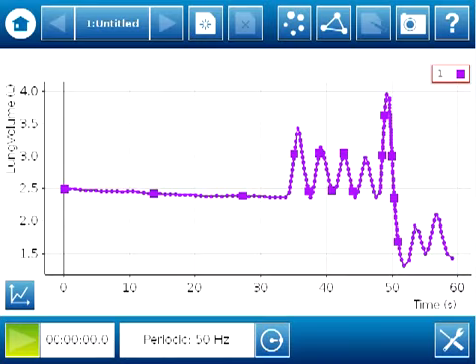In this video, we'll focus on using the built-in tools of SparkView software to analyze data related to changes in lung volume. In part 1, I collected data under two conditions: normal breathing and maximum inhalation followed by forced exhalation. We'll use that data to find tidal volume, vital capacity, and forced expiratory volume in 1 second. Let's revisit the graph of lung volume versus time from part 1.